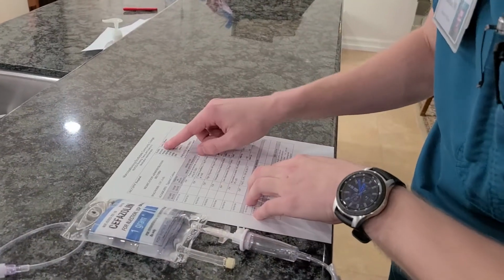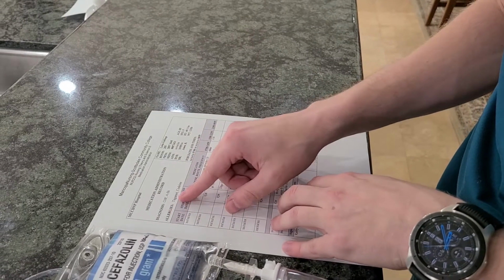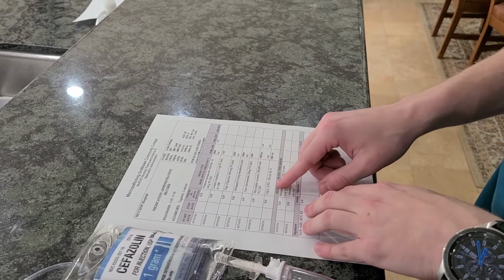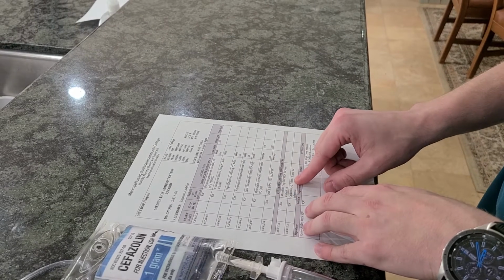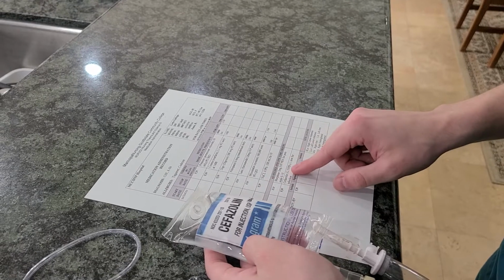So I have patient Lotta Fallings, date of birth 10-5XX, allergies to Tagamet and codeine. So we have the right patient. Now we have cefazolin, 1 gram IV piggyback. So I see here cefazolin, 1 gram. So cefazolin, 1 gram IV piggyback.